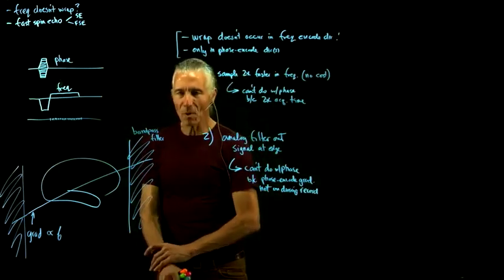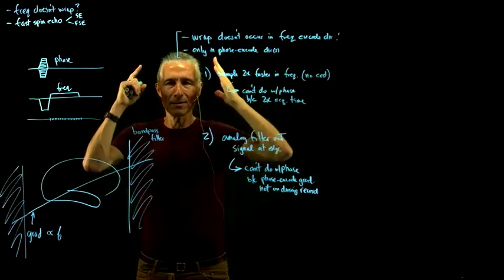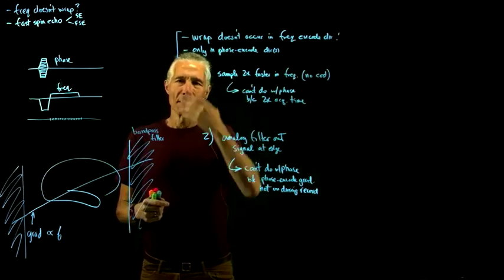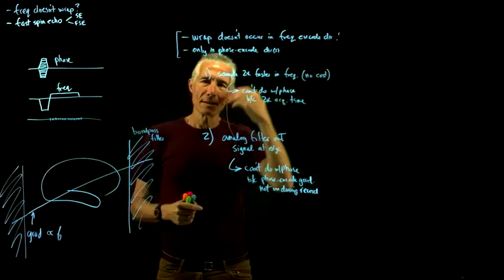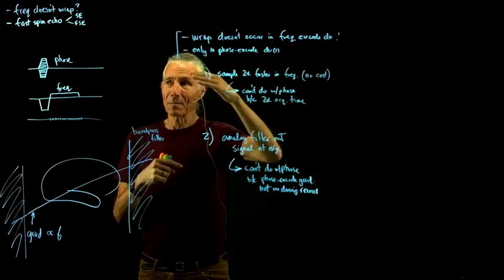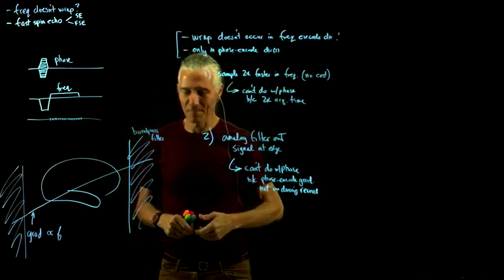And for most things that isn't a problem. Like if you're talking about going this direction across the head, well, there's black on either side of the head, so it's not a problem. It is a problem with the head and the neck. So the neck can sort of wrap around back into the top of the head if your field of view is not as big as the thing that you're taking a picture of. If you're taking a picture in this direction in the sagittal plane, you've got a body on one side.